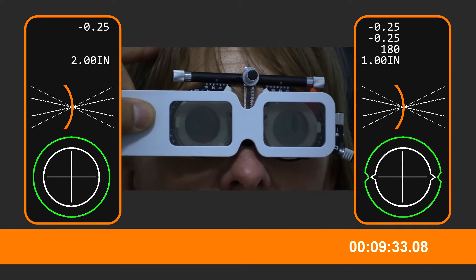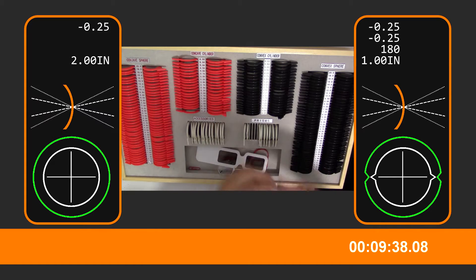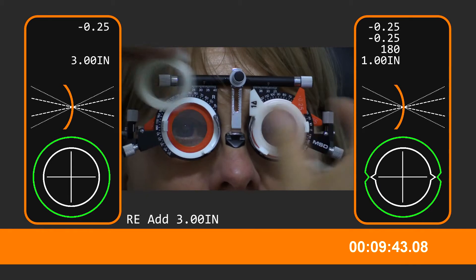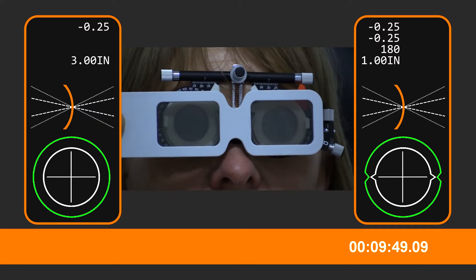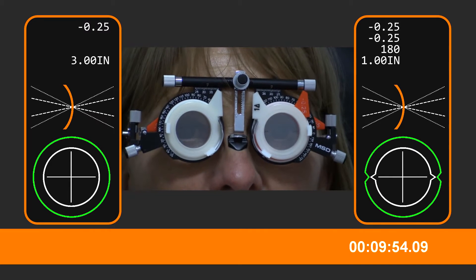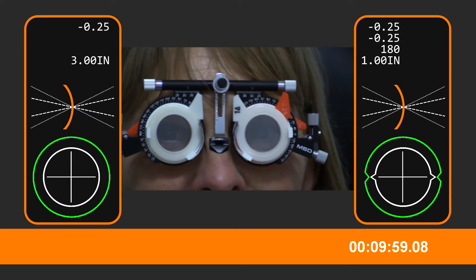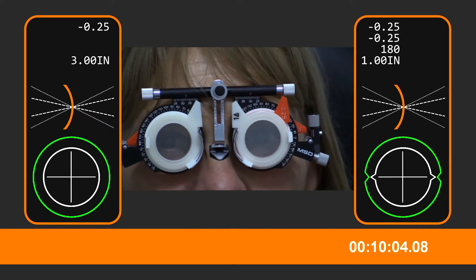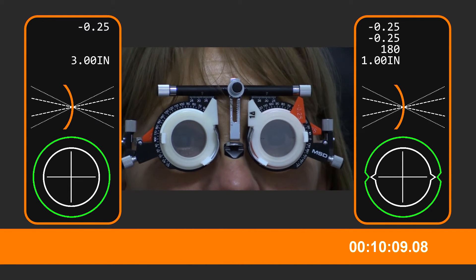What about now? Yeah, that's better again. This is the prism that you've got in your current glasses. There you go, if I put those ones in there. Yeah, it's reasonably okay. As does my usual one — I normally get exactly the same. What the prescription was before. Two base-in, aren't you? Yeah, two base-in in each one, according to the record. And that's four base-in, that is.